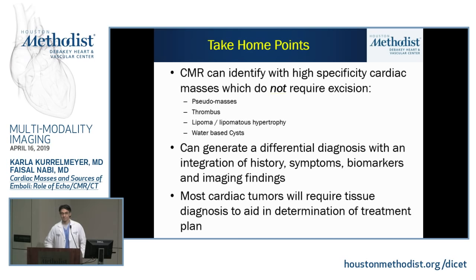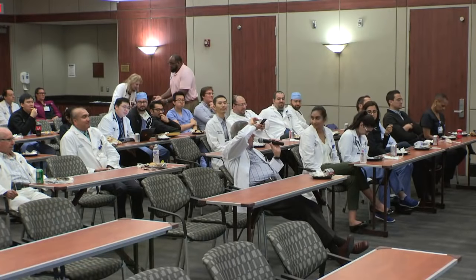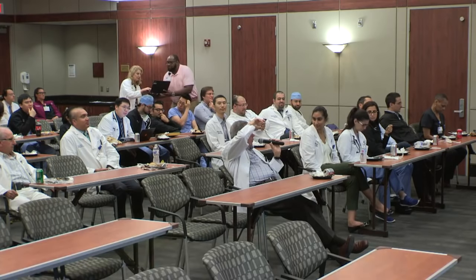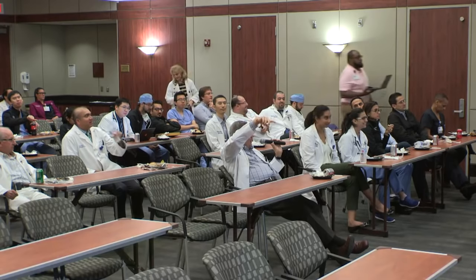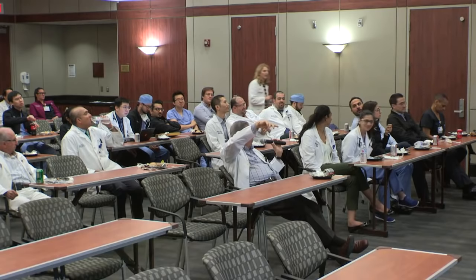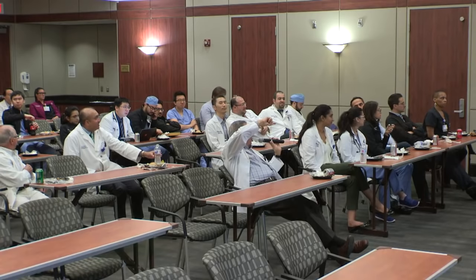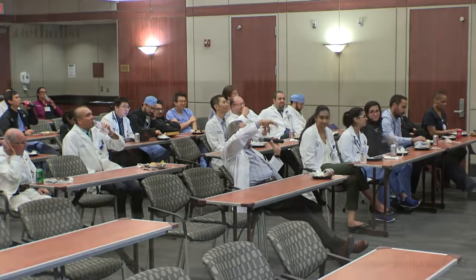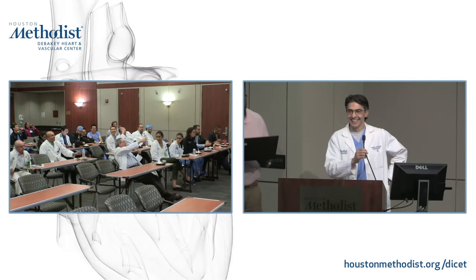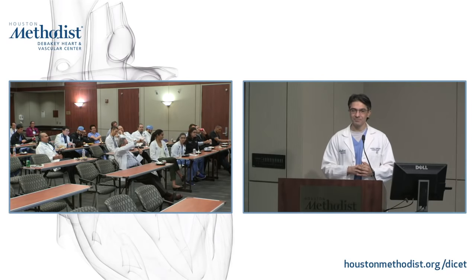All right. Quick question. Last year, remember, we had a case. There was a lot of controversy between CMR and CT. The patient went to surgery. Refresh my memory on that case, because that case was fascinating. It was a clot, right? It was a clot, but CMR was struggling with it, right? I'm not bringing this up to shame you. It's just, what were the explanations for that problem?